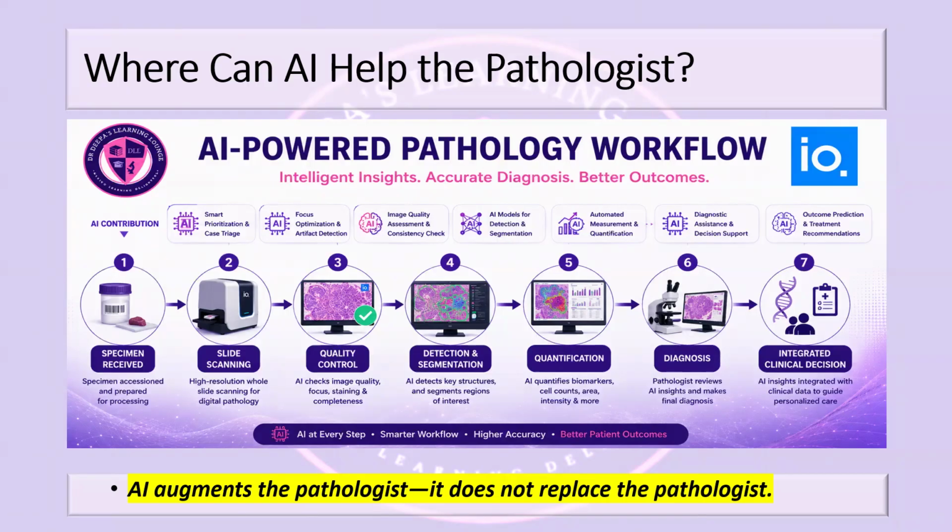By reducing this, once this number is already done by the AI, once you open the whole slide image and then you are picking up these spots and then you are telling it to quantify this, there is a number that it is giving out. And that number definitely is the same that you and your other pathologists are looking at. Okay, so the chance of inter-observer variability has come down very much, right? Because the AI is already giving it to you. All that you are doing right there is yes or no. So the inter-observer variability and the chance of you missing out something is far lesser when there is an AI partner with you.